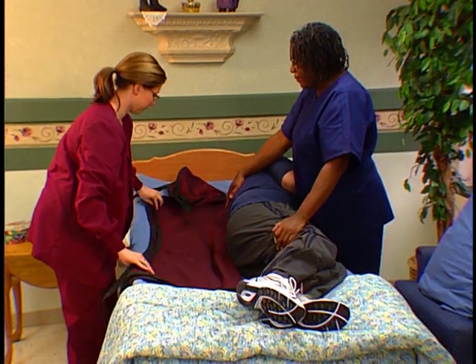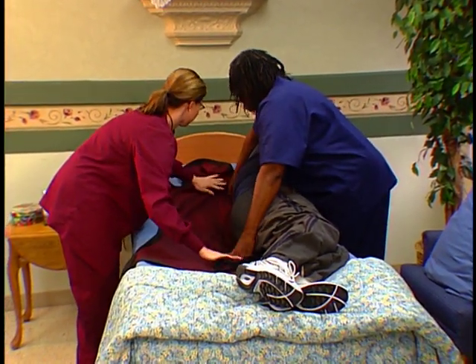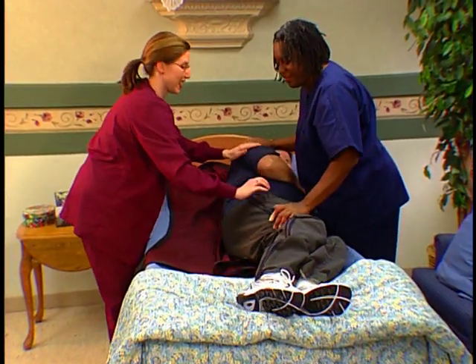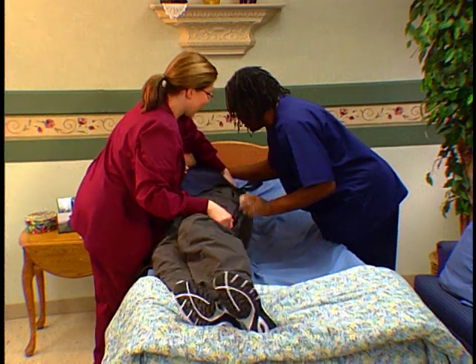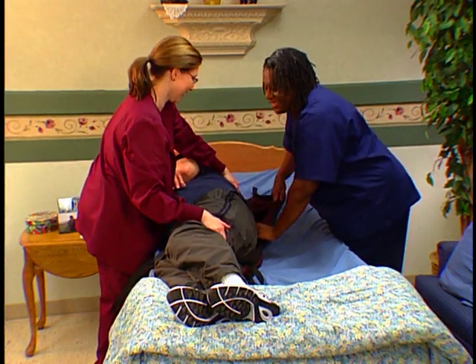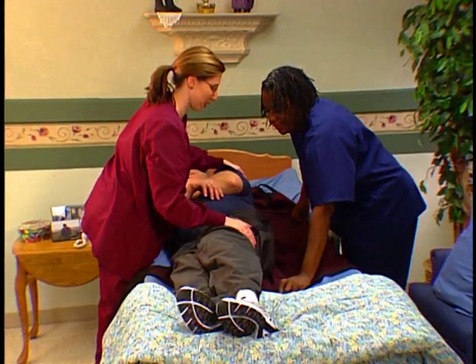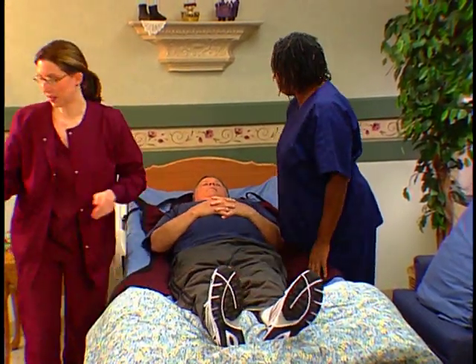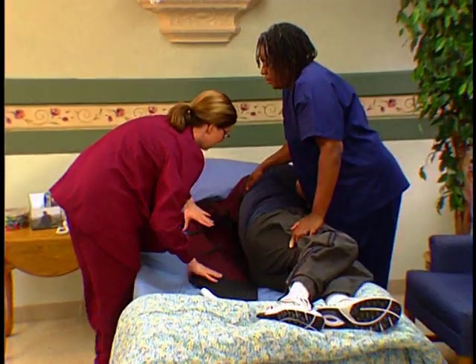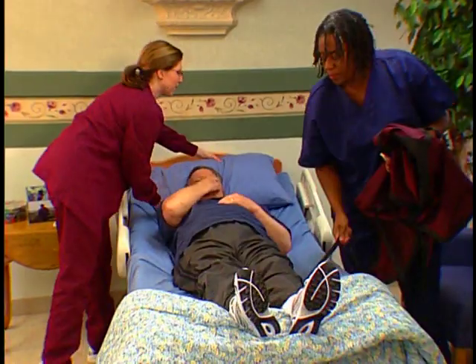Position it so the bottom of the sling is centered at the patient's tailbone. Tuck the sling close to the body, making sure the top of the sling is aligned with the top of the person's shoulders. Roll the resident to the other side, pulling the top portion of the sling out. Smooth out any wrinkles. You are now ready to attach the sling to the lift and transfer the resident. To remove the sling, simply reverse the previous steps of placing the sling.